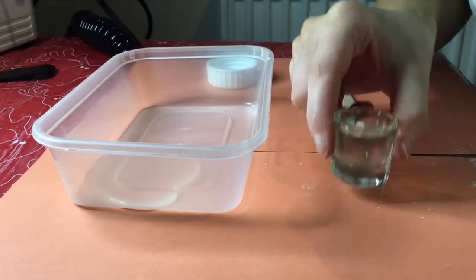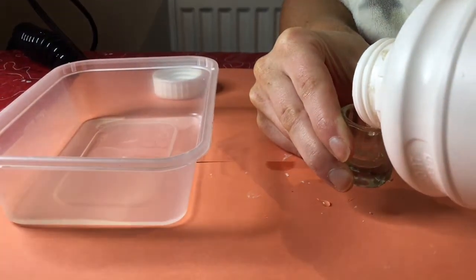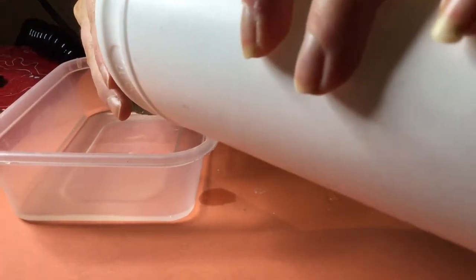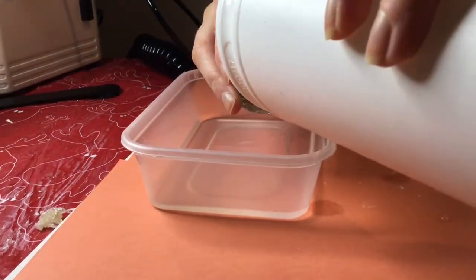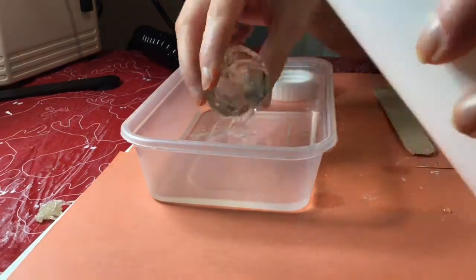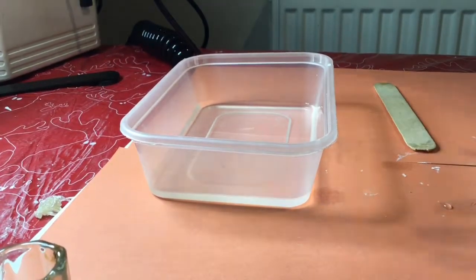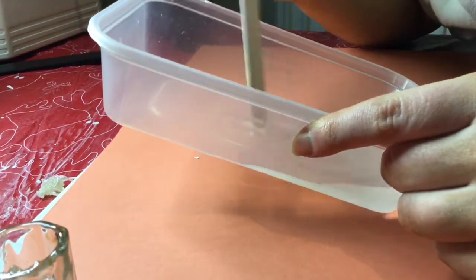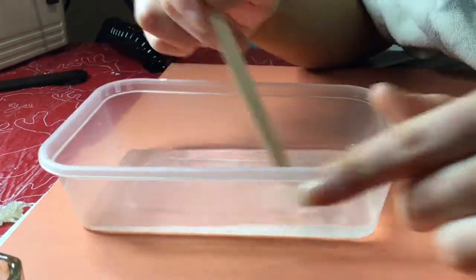Once I was positive that I was ready to start, I sprayed epoxy parfilm over both parts of the mould in a well-ventilated room and began to mix my encapsulator. I mixed with the ratio 1 cap of encapsulator to 5 caps of acetone. It was important to mix the encapsulator to this consistency because if it was mixed too thick, not only would it not flow through the airbrush, but it would make the edges of the piece difficult to blend as they would be too thick. Once I had mixed the encapsulator to a consistency I was happy with, I poured it into the cup of my air gun.